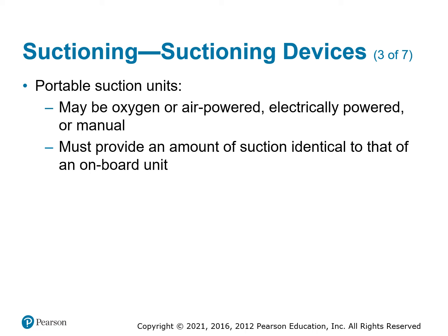They could be oxygen or air powered. It could be electronically powered. Many of them have a battery that has to be charged. And then there's the manual ones.